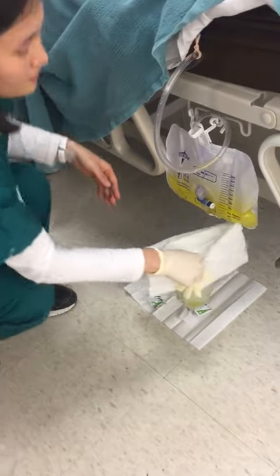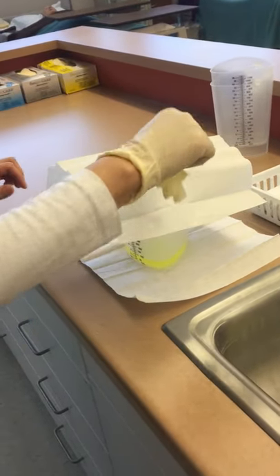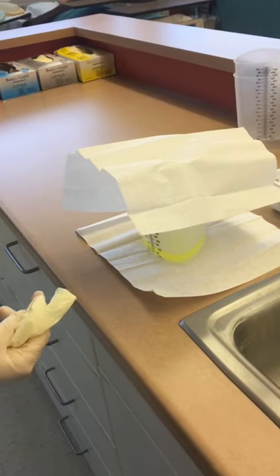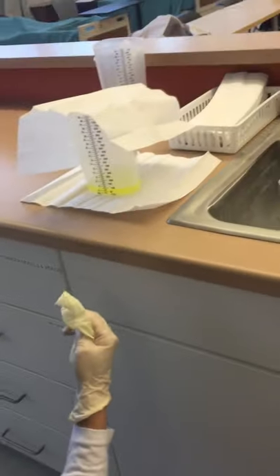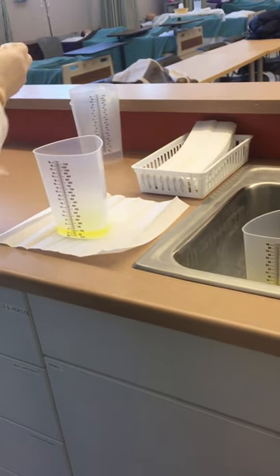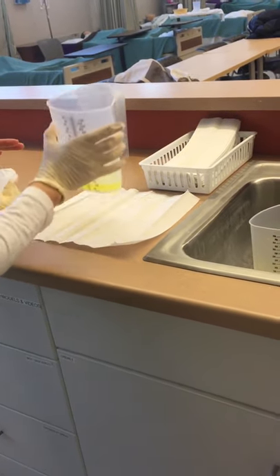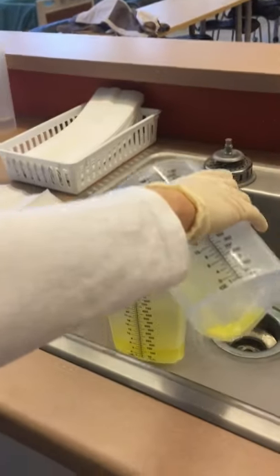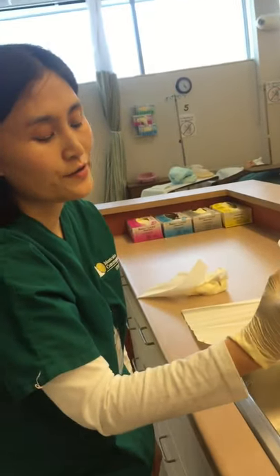Take it to the bathroom and place the graduated cylinder on the barrier. Measure the urinary output at eye level. Then dump it in the toilet and rinse the graduated cylinder with water.